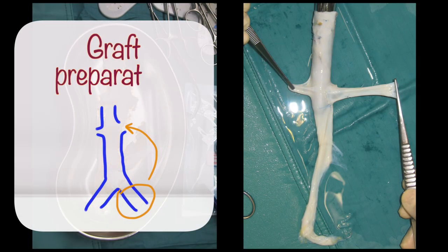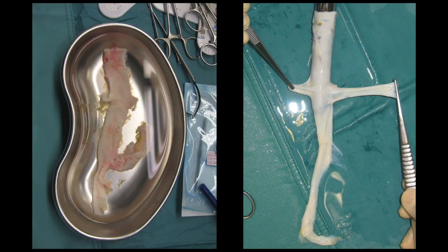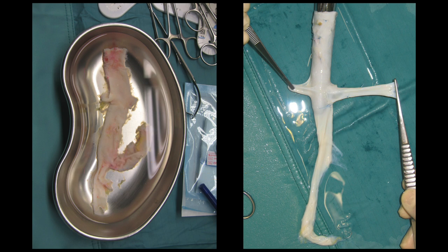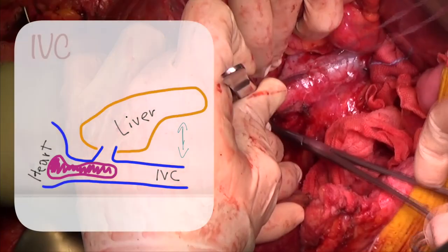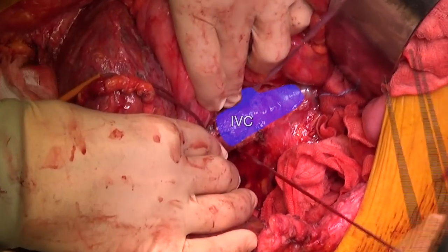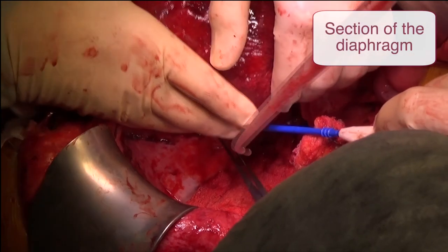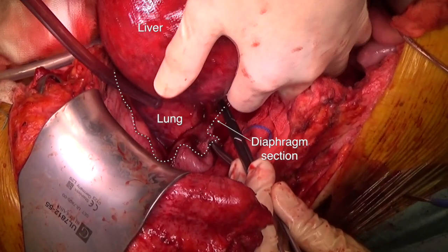The first preliminary step was to modify an IVC homograft by suturing the right iliac vein onto the ipsilateral renal vein in order to reduce the liver ischemia time. After a J-shaped thoraco-abdominal incision, a long time was required to separate the liver from the surrounding structures and from the IVC.